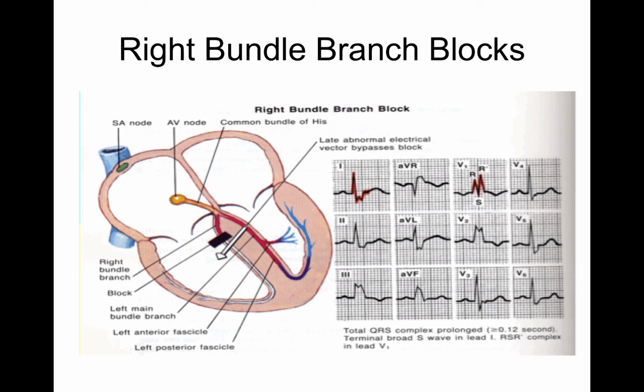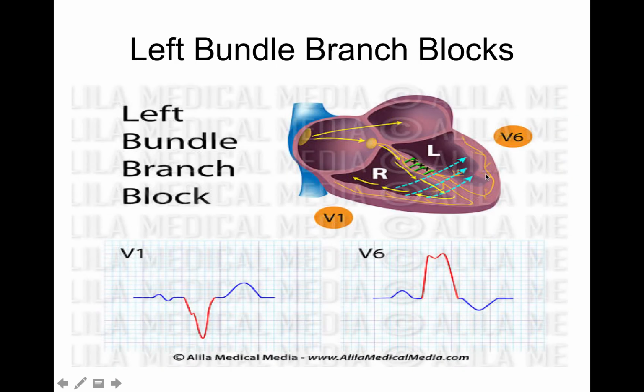If you have a 5 lead, you can augment the leads and get that ventricular lead, the modified chest lead, and then you can do V1. So your EKG is going to go up, to the right. That's going to be a right bundle branch block.